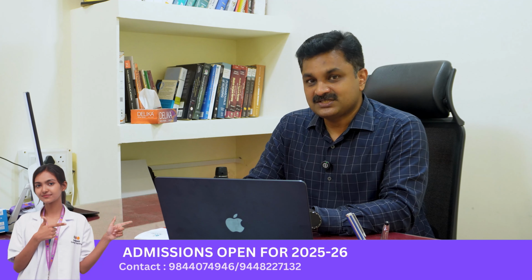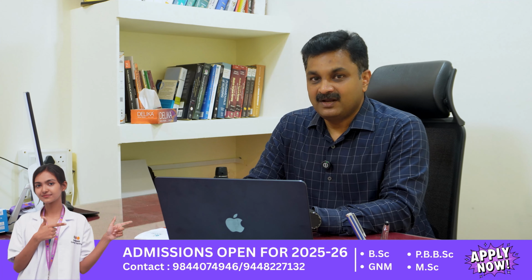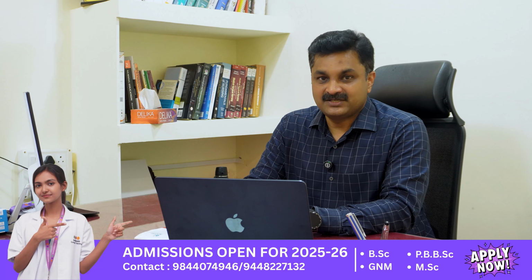But in certain situations, not everyone is confident enough to read or diagnose ECG abnormalities. In such situations, the AED will help you. As the name indicates, automated, the machine itself will determine whether a shock is required, or whether the person has a shockable rhythm, that is again VF and pulseless VTAC.